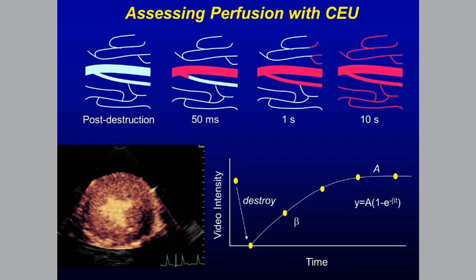And so generally, if we're doing agitated saline contrast to rule out a shunt or something along those lines, we essentially wait until we barely see any kind of bubbles whatsoever on the right side. It's amazing how few cavitation nuclei it takes to enhance a Doppler signal. So don't go wacko on it.